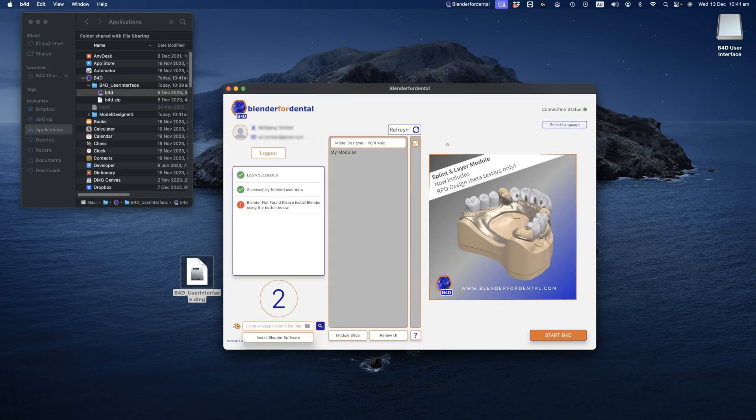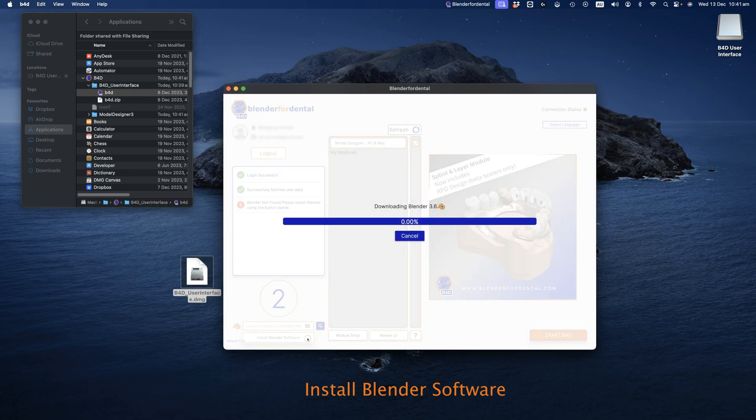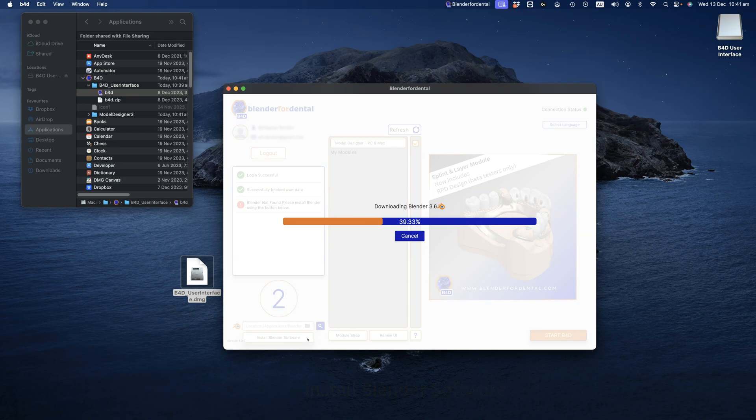Following this, proceed to install the Blender software program. Blender4Dental is designed to run exclusively with the compatible Blender version. The user interface will conduct a check to verify and ensure the correct version is installed. Allow some time for the software to download.